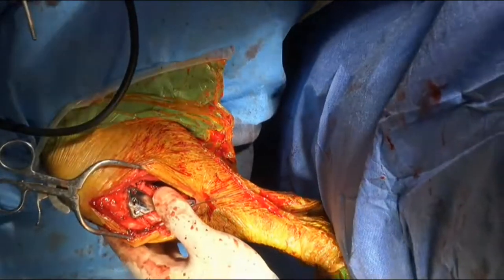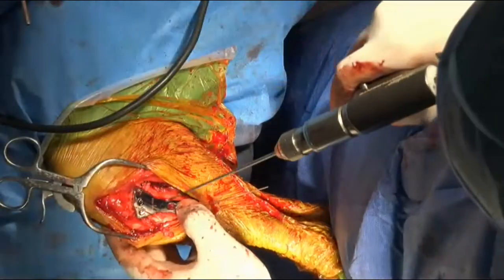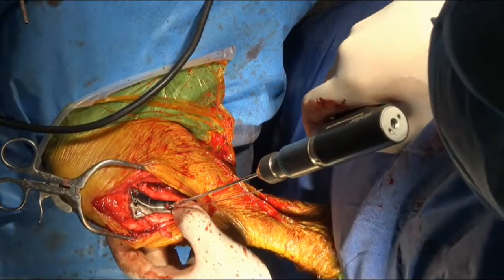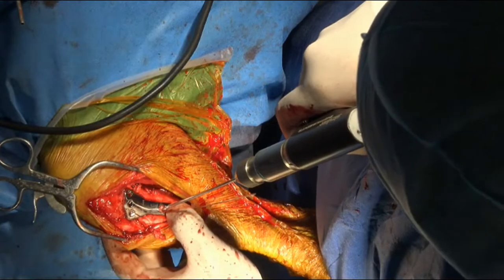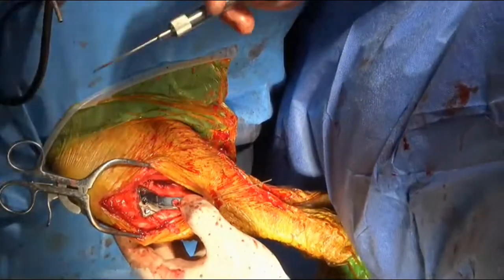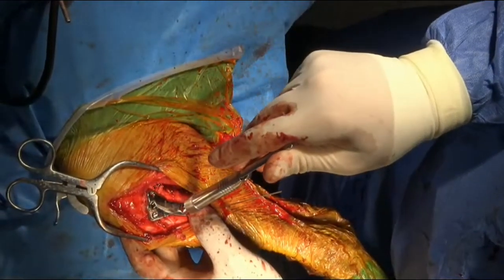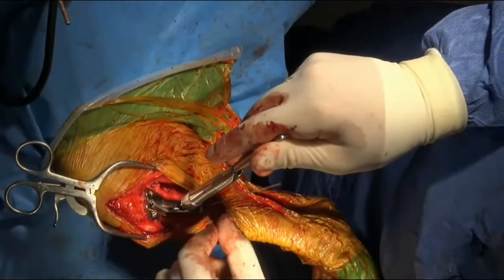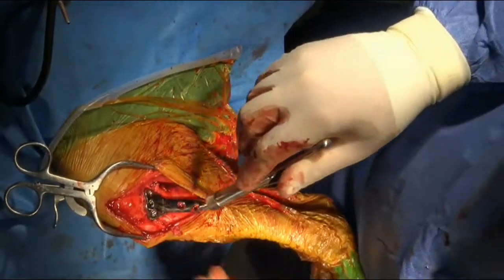Okay, can I get a locking screw, please? Actually, 2.5, yep. So the first screw we're going to put in here is going to be a cortical screw, 3.5 cortical, so it's a 2.5 drill. We need just a regular screw key, please. And then I'll get a 20 when you're ready.